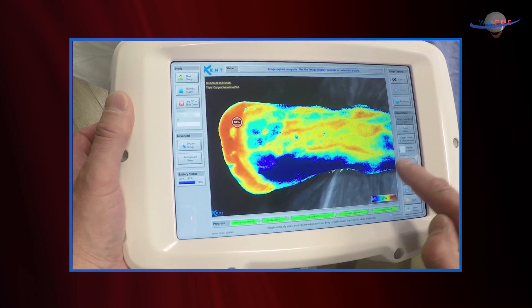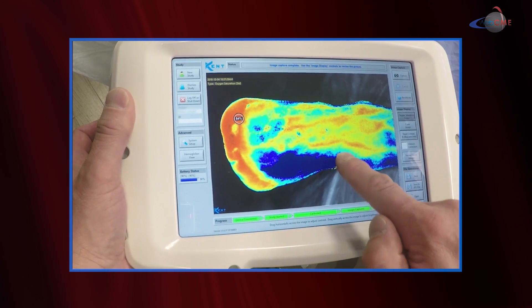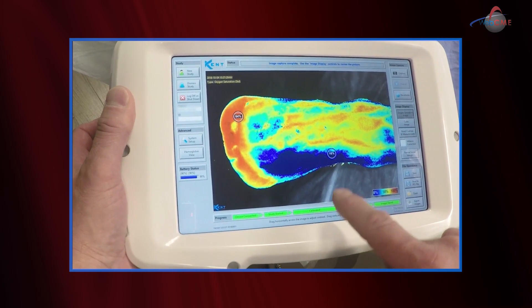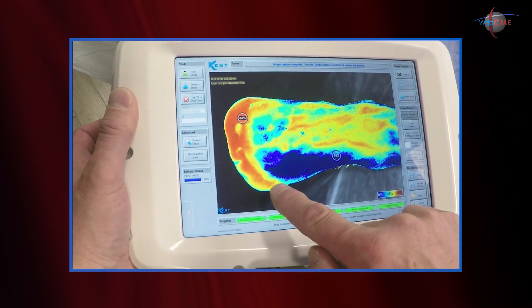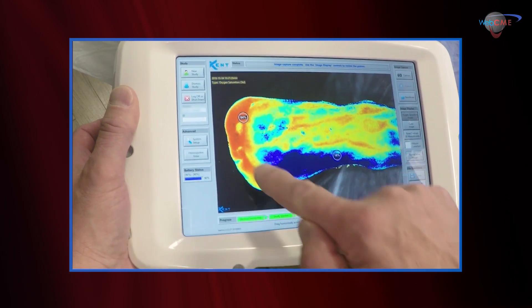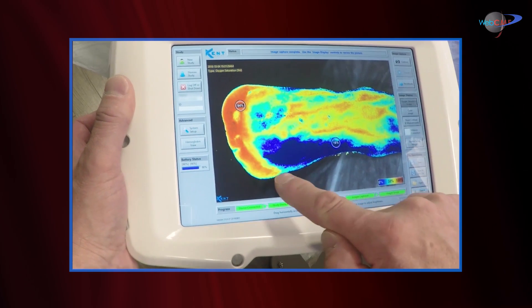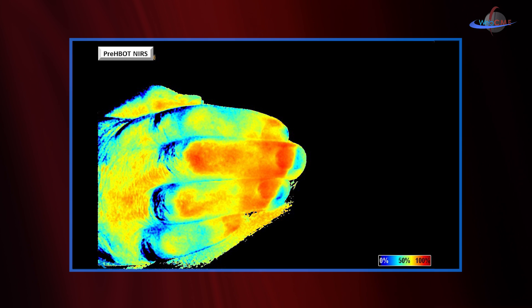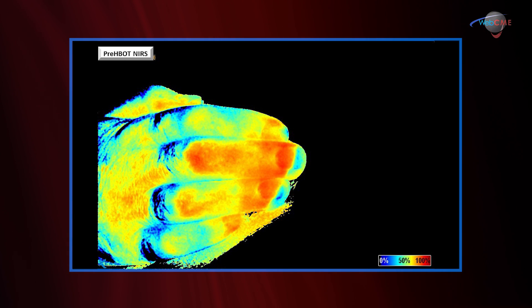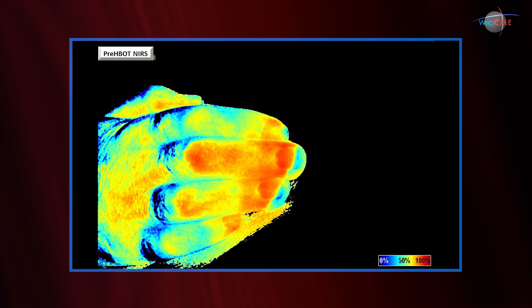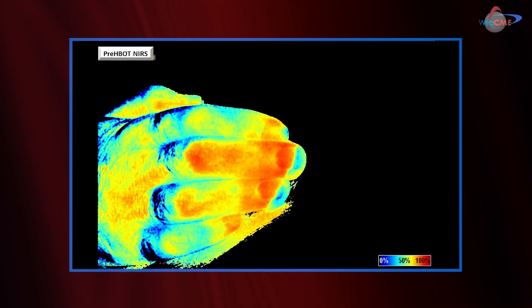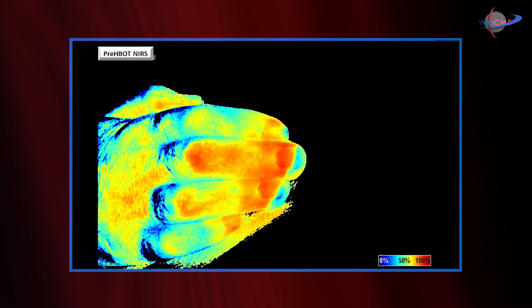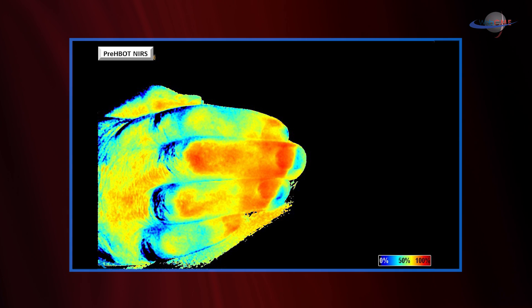Using this computer interface system, the camera can generate an interactive computer model. You can tap on the images and see the tissue oxygenation percentage throughout the extremity you photographed. We are using near-infrared spectroscopy at AZH clinics here in Milwaukee. This is an image of that same patient using the Kent Imaging near-infrared spectroscopy, and as you'll note, the tips of the third finger and ring finger show bluish discoloration, clearly indicating less oxygenation.